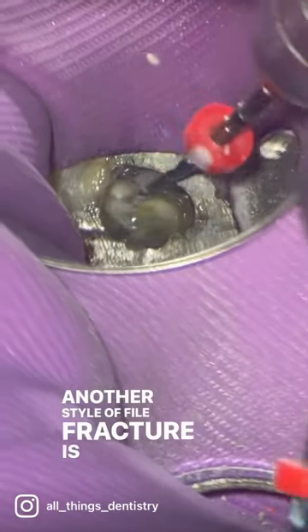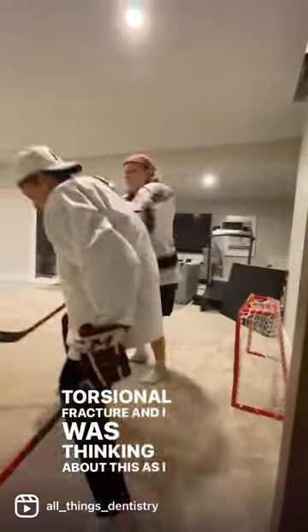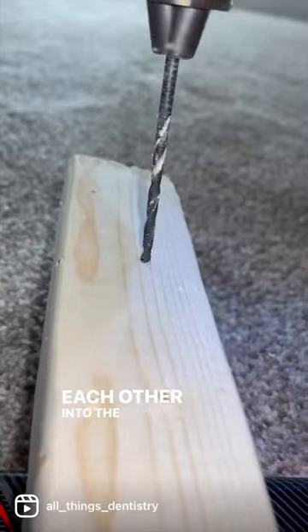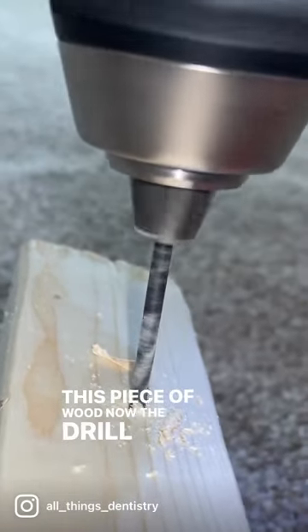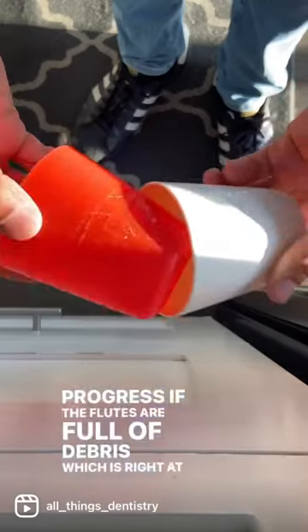Another style of file fracture is called torsional fatigue, torsional fracture. I was thinking about this as I was fixing a hole for my kids playing mini sticks and hitting each other into the drywall. When I was drilling a hole in this piece of wood, the drill bit will not continue to progress if the flutes are full of debris, which is right at the bottom there.